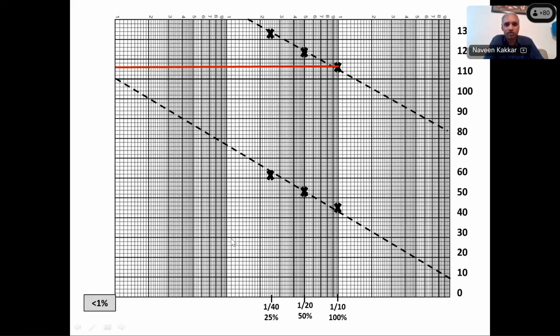This you can actually download from the internet also. It's freely available. Your local stationery may not have this that commonly. And then on this axis, you have the times in seconds. That is, not the aPTT now, your factor assays. Remember this for the factor assays.